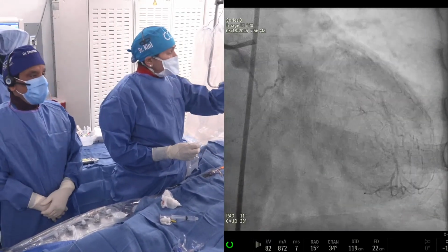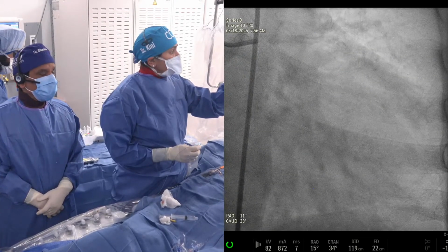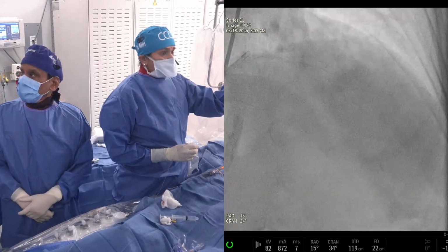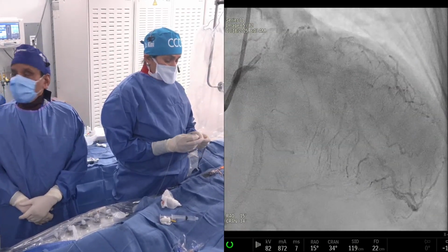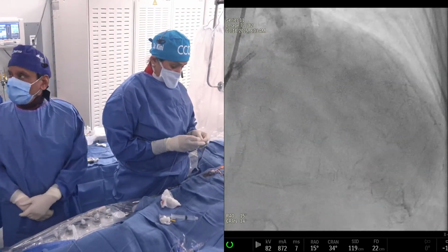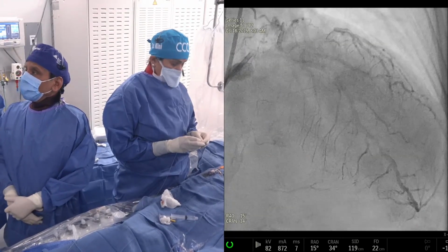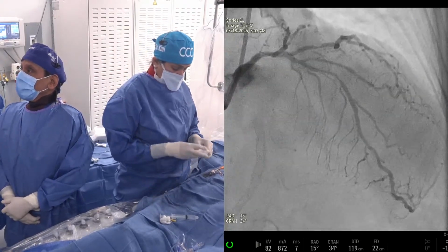And the LAD calcium. Even if you go to your next picture, you can see here, this is without dye, tram track calcium, and this is where your cranial LAD picture is. The question is how many branches are we going to treat? Definitely the D1, although it's not truly a 111, it's just a little off the bifurcation, a very tight lesion, but once you are there, it will be involved. Then D2 is another definitely involved.